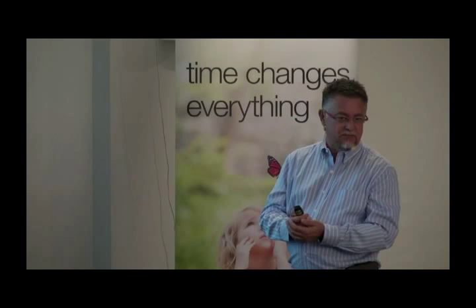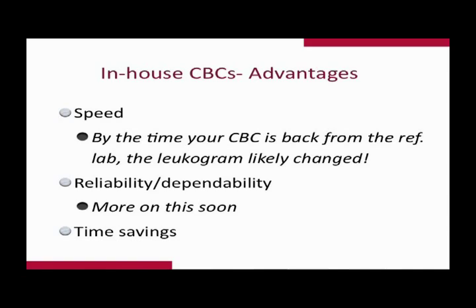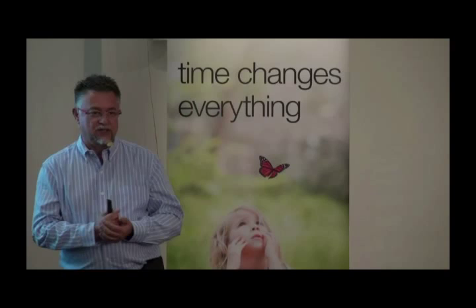So for me as an oncologist, one of the beauties of doing in-house hematology is the speed. I put the sample in there, and remember, we veterinarians are not very good at following instructions, you guys know that. There have been plenty of studies that look at how veterinarians compare performance-wise with technicians or nurses in performing diagnostic procedures, and the nurses are way better than we are. Because when it says 5 seconds, for us 5 seconds is 1, 2. When it says 3 drops, we say, well, we can probably spare 1 drop for the next dose, so we would use 2, and so on and so forth.